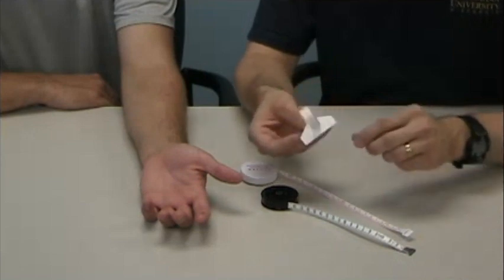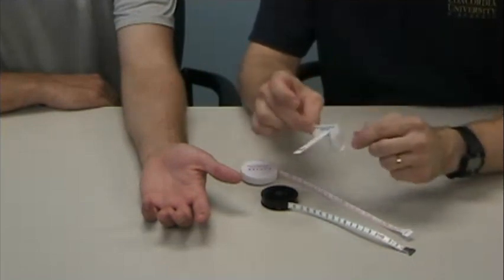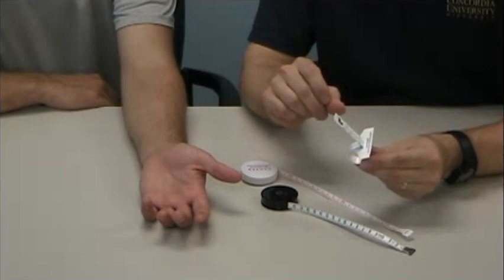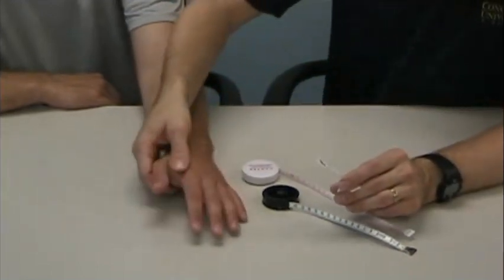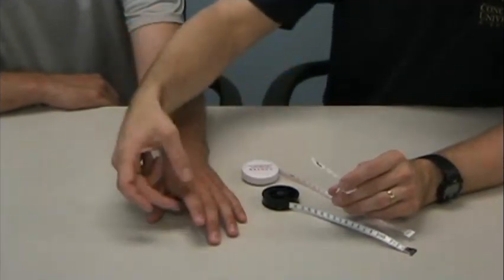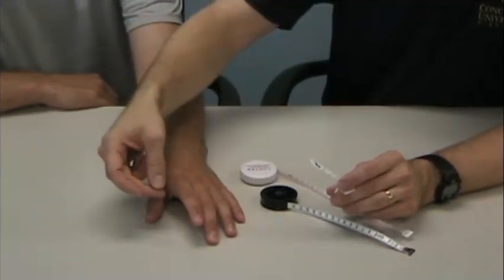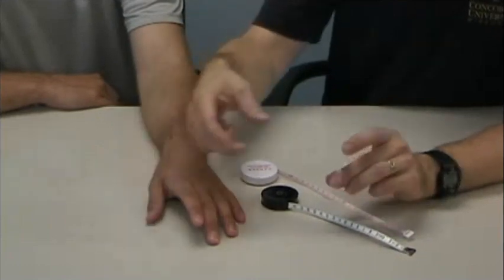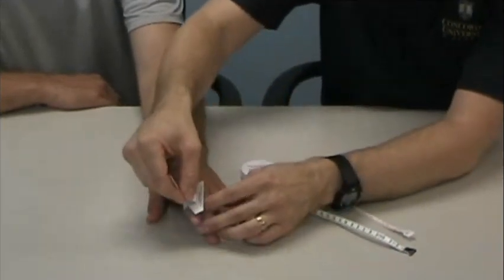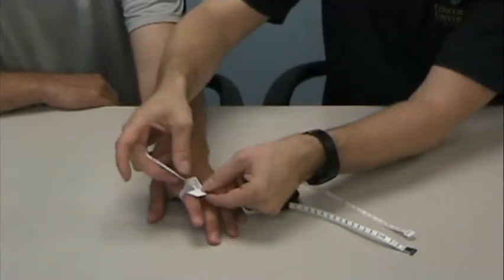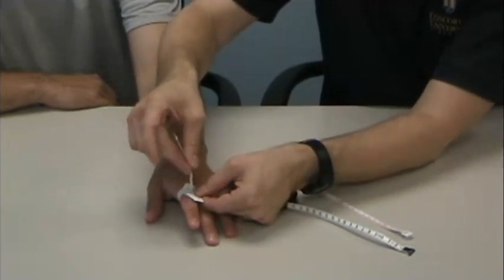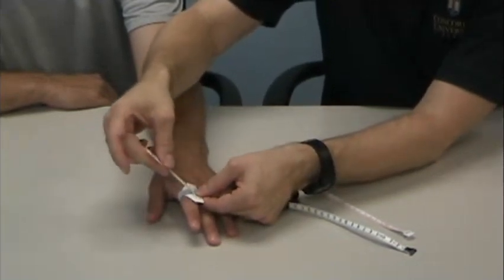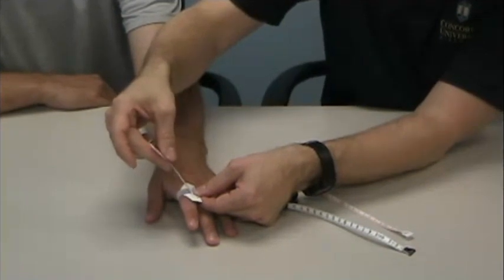Let's start with what is basically a specialized centimeter ruler for circumferential measurements of a finger. Typically what I would do with this is, let's say I want to measure the edema around his proximal phalanx. I'm going to take this and put it around here. It has this little hole that the measuring tape goes through, and you just snug it up there until you get it about as snug as it wants to go, and then read the measurement.